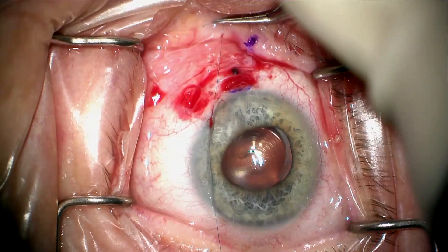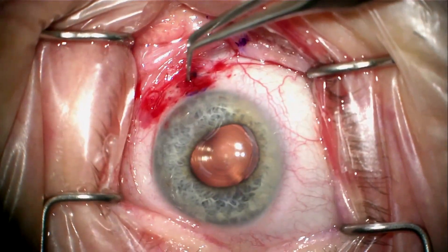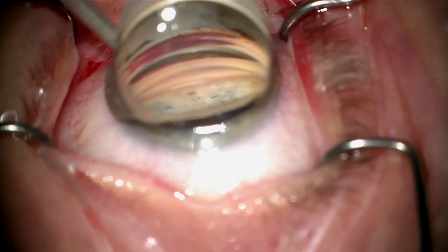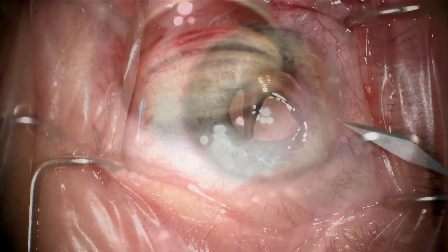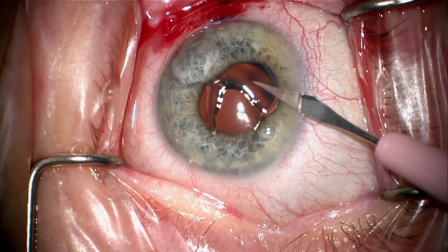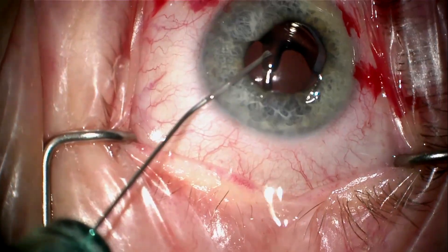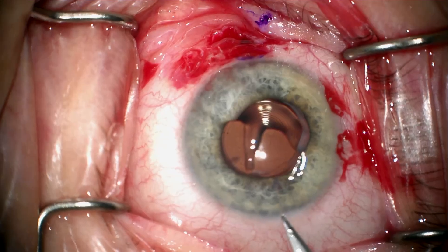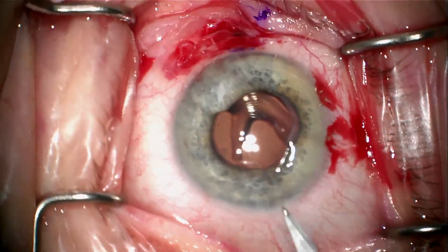I'm going to tie this with a 3-1-1 knot and rotate the suture. Once this is done, I'm going to re-inspect with gonioscopy. It looks to me like the cleft might still be open and I'm concerned. I want to make sure that I absolutely close this. I don't want to have hypotony after taking her to the OR. So I'm going to do a second approach — an ab-interno approach under direct visualization that I saw first from UC Davis Eye Center.